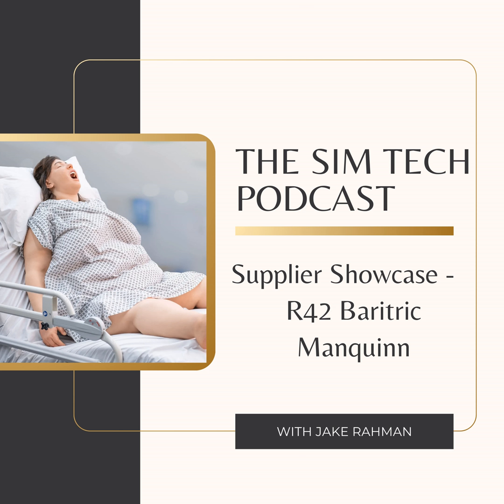Because of that kick to make R42, it's actually had some really good results, because there will be some other mannequins based on the design of R42 that will be coming out. And just to mention as well, R42 is what I would say the world's first totally 3D printed mannequin. Apart from the skin, which is obviously silicone, the inner is 3D printed, and that means things can be changed really, really quickly.